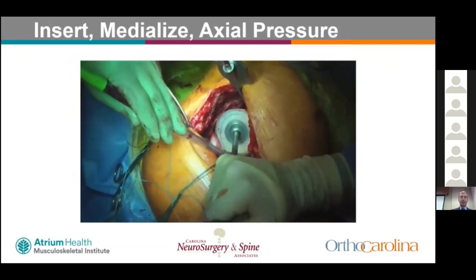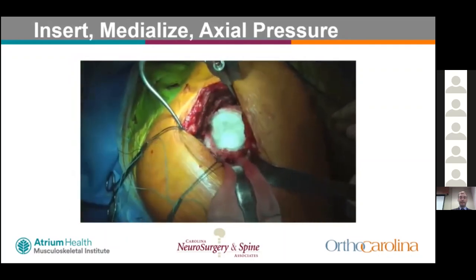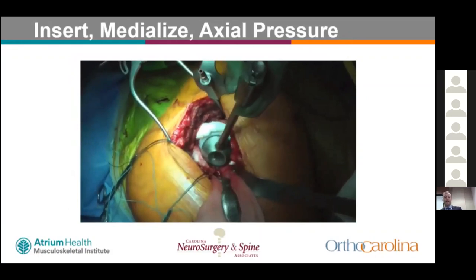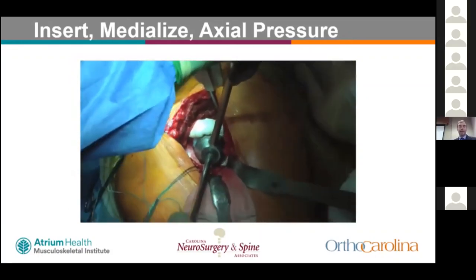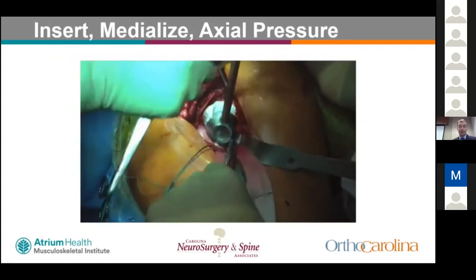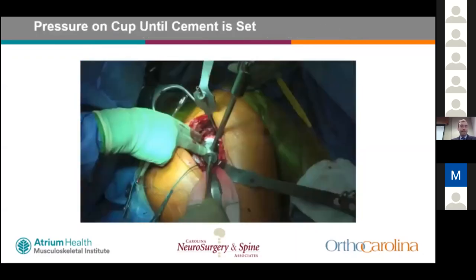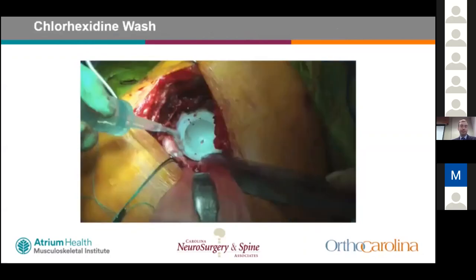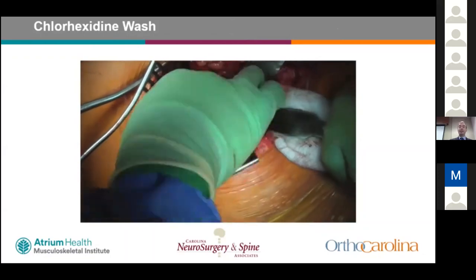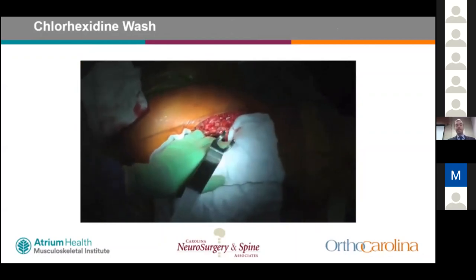They then insert the cement and seat the cup. The technique is very technically challenging — getting version correct is difficult and there is essentially one chance to position the cup correctly. Once cement is set after sustained pressurization, the final result shows the fully cemented acetabulum. The surgeon said it adds about five minutes to his case, though there is a high learning curve. This technical difficulty has driven many U.S. and other countries away from this technique.